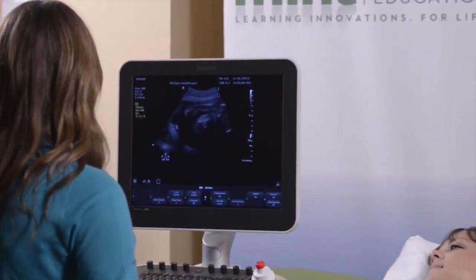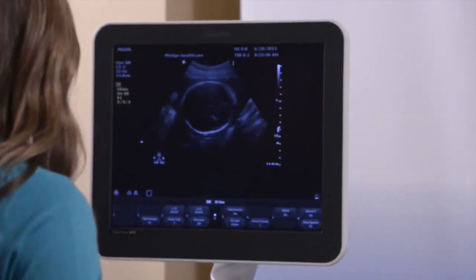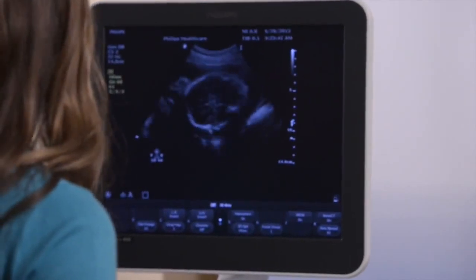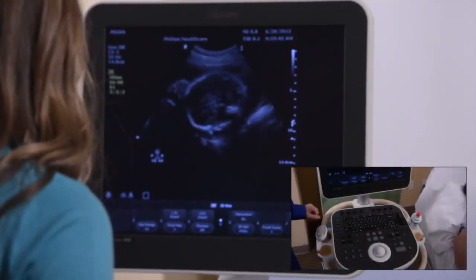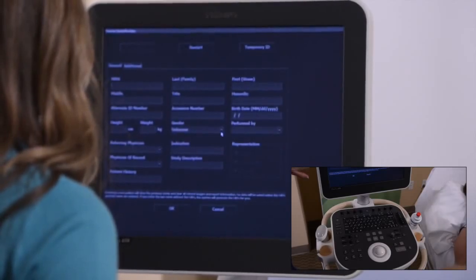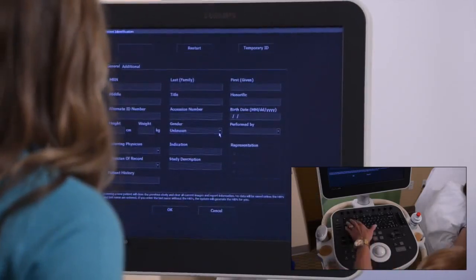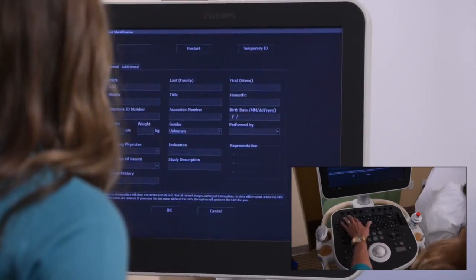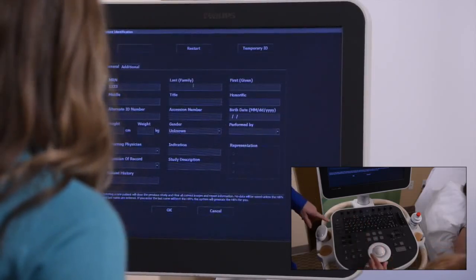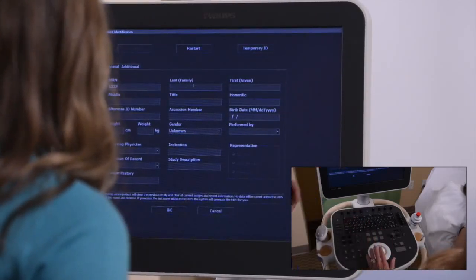Linda, to get started, if I put the transducer down, first thing I want to do is put the patient information in. Can you show me how to do that? Certainly, we have a patient data entry key here. You'll notice here that we have all of the information that we would want. You just use your trackball, place a number, and then you can tab over and put the last name.